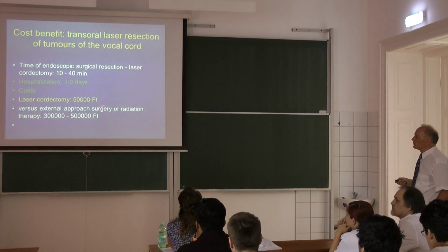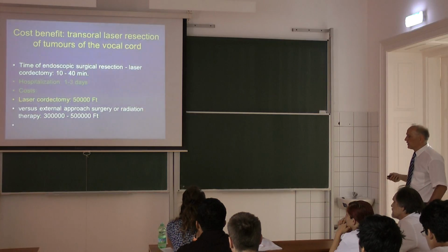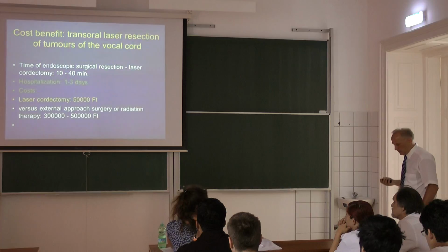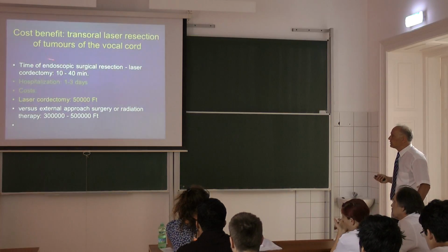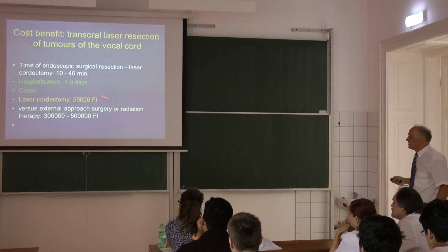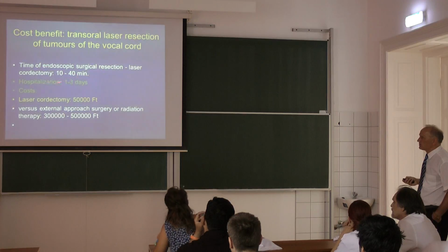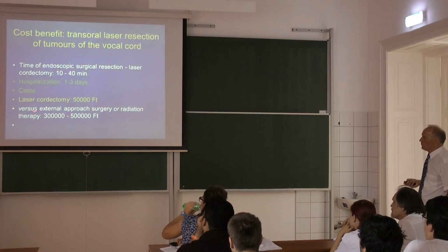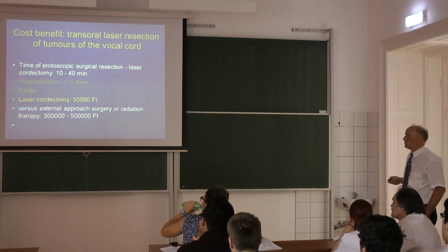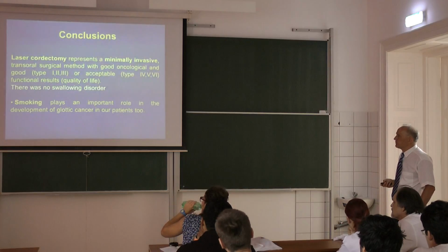So what is important from the practical aspects, we achieved quite good practice in the laser treatment. The endoscopic resection takes just 10 to 40 minutes, and the hospitalization is 1 to 3 days, versus external approach surgery, which lasts weeks, or 1 week at least, and it's much cheaper.